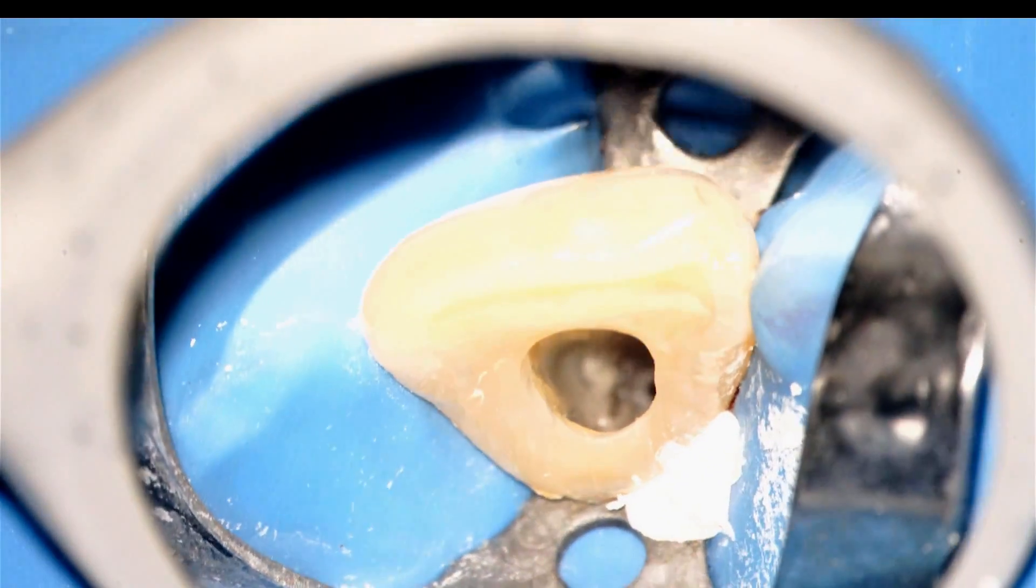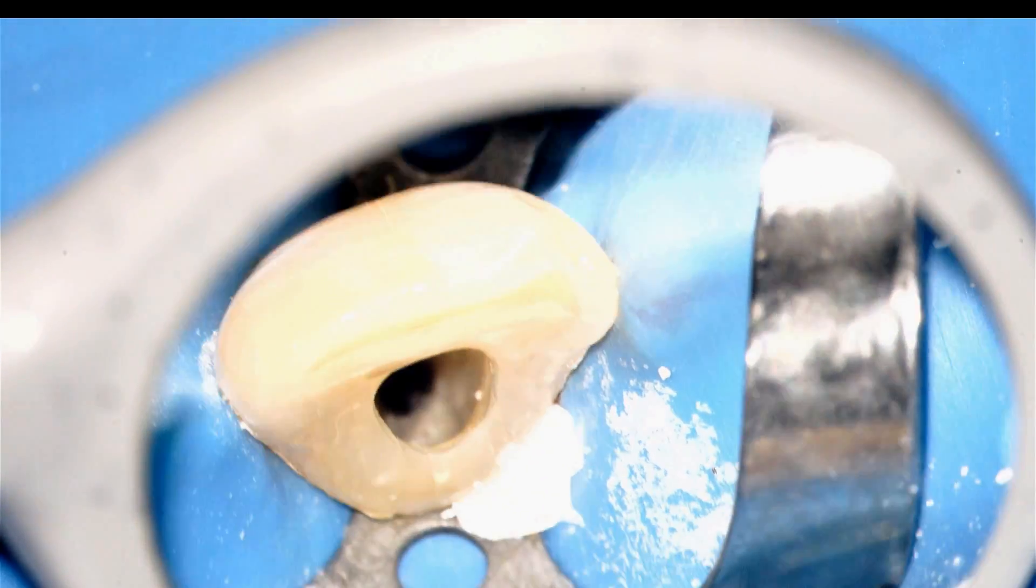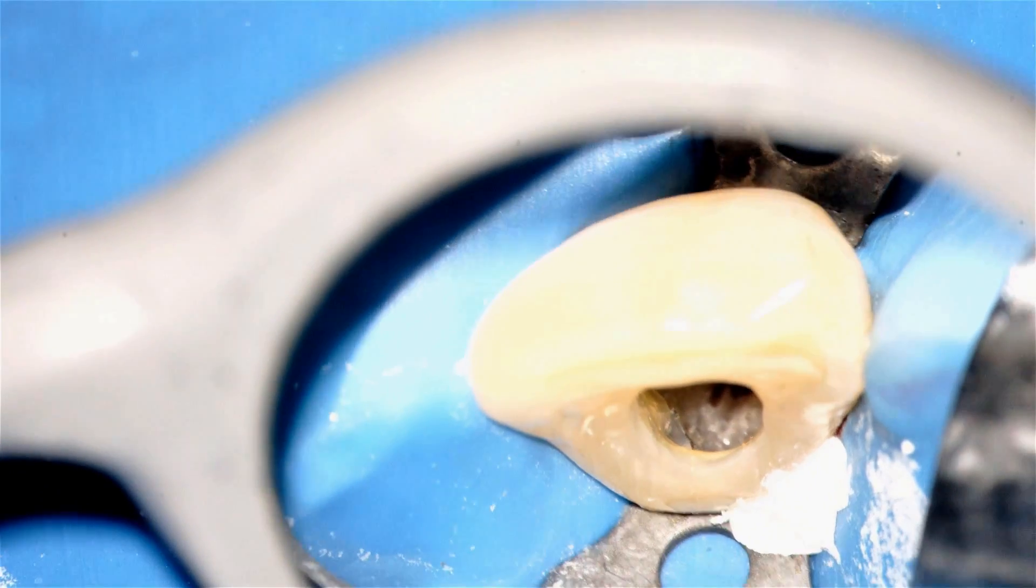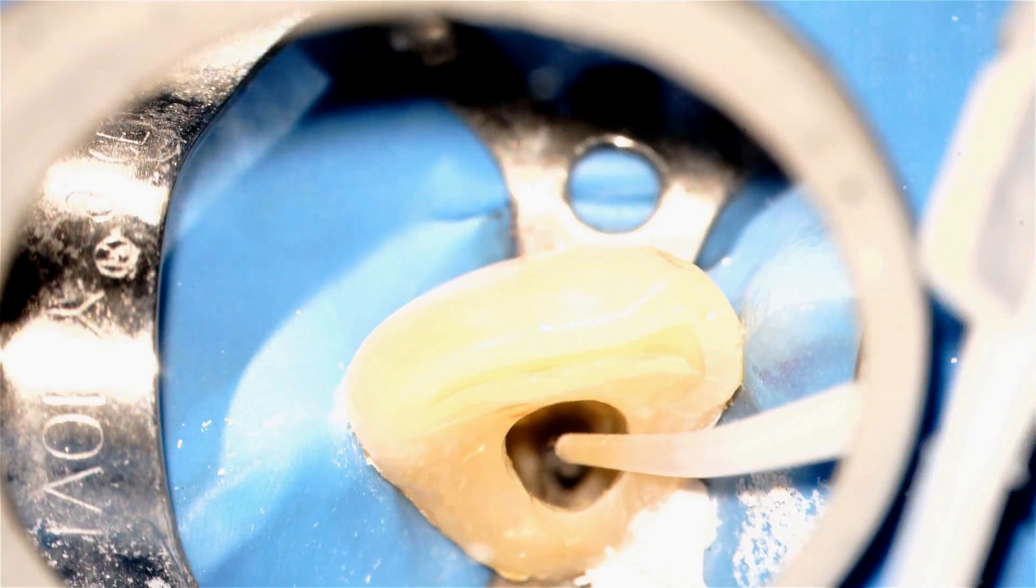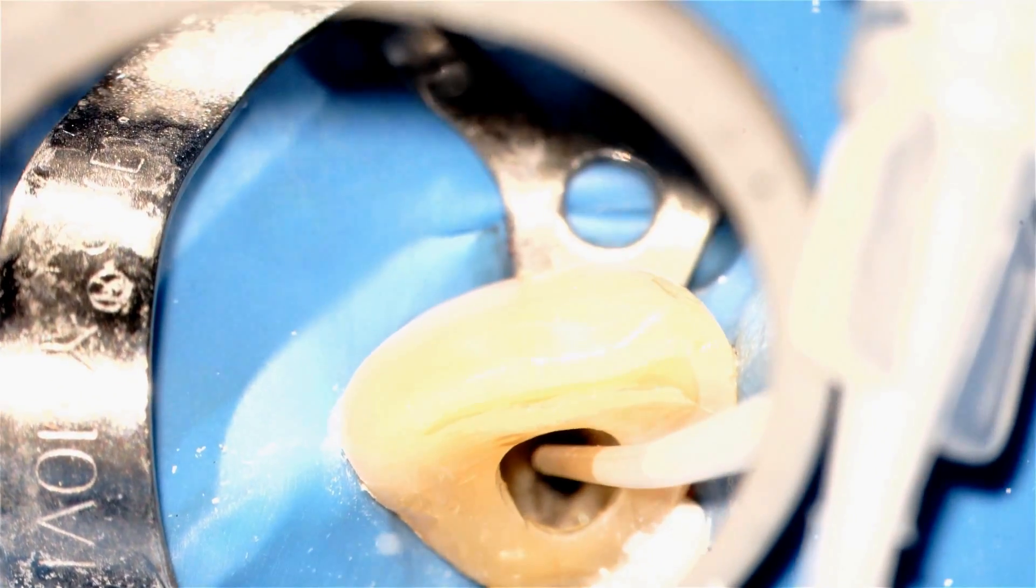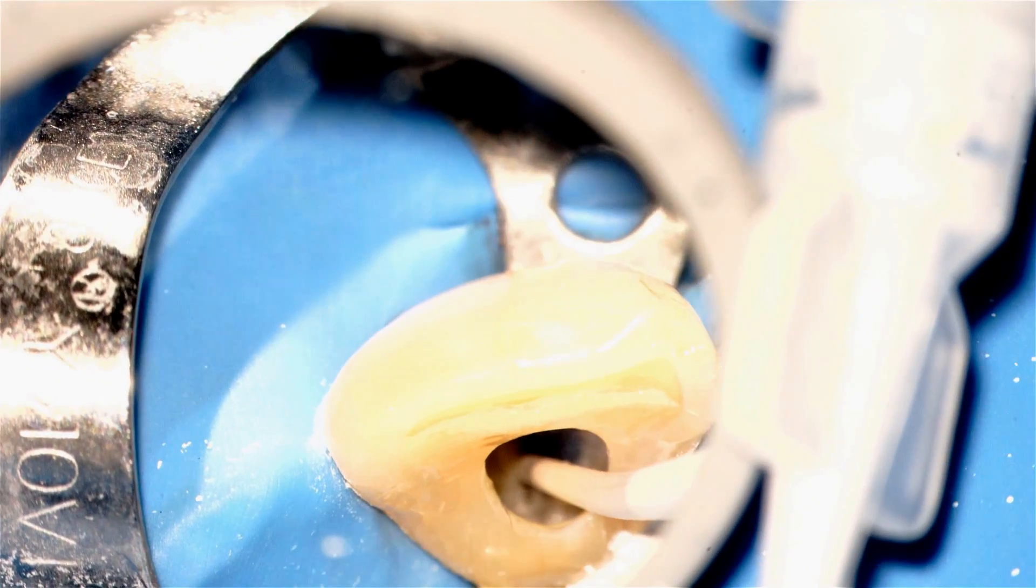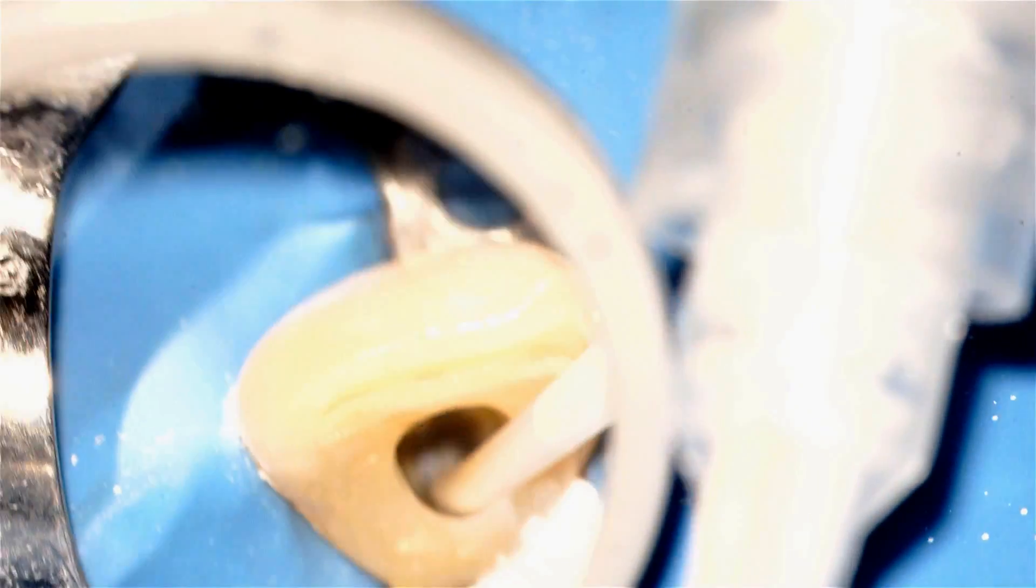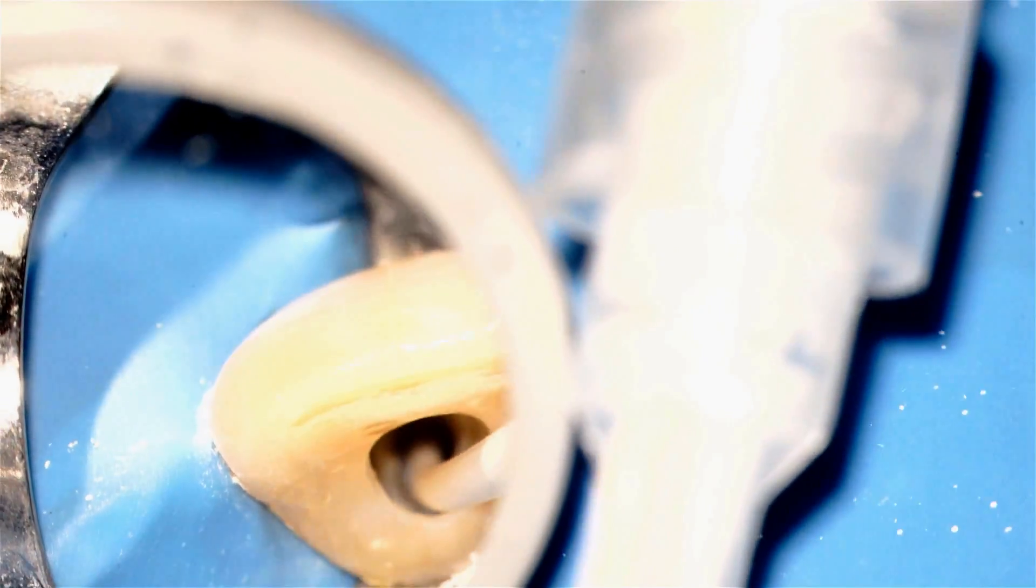You can note that the lingual-distal lingual defect corresponds exactly to what we saw and mapped on the CT. This is the application of the endosequence bioceramic. It comes in a very narrow syringe with very high flow, and it can be injected deep into the canal.